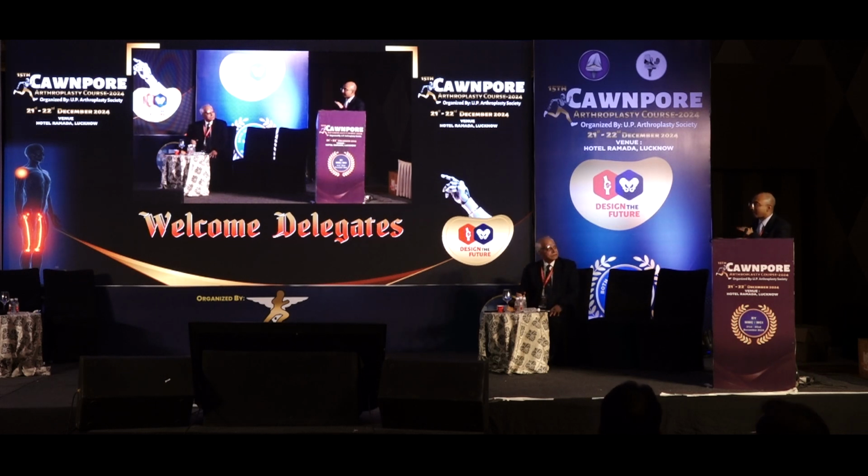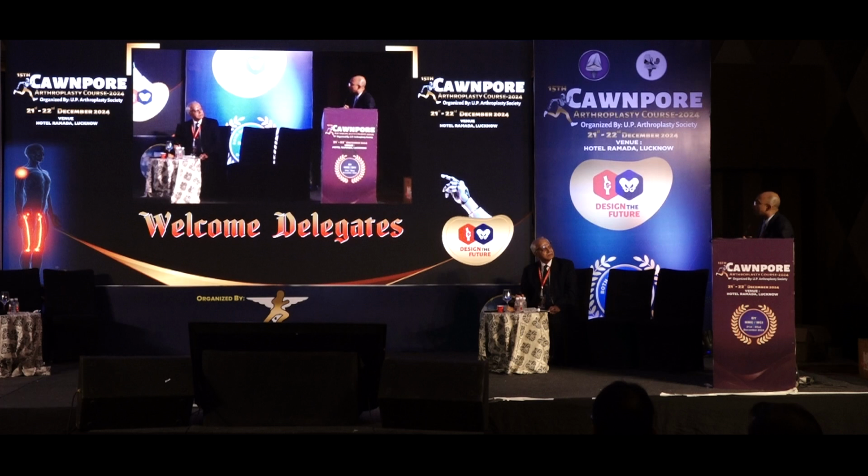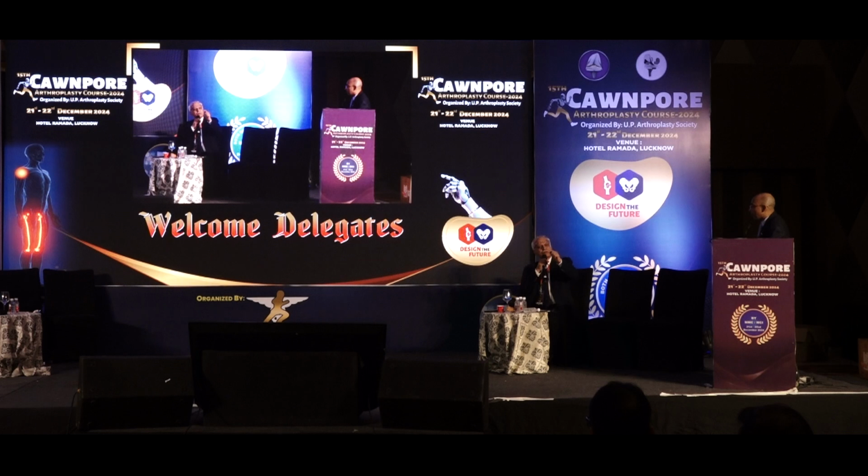Sir, if it is a 5 to 8 mm defect and only 10 to 15% of the tibial tray is uncovered, maximum 20% in the posterior part, then probably I will not use a rod, but otherwise I'll use a rod always. If the defect is only in the posterolateral or posteromedial, less than 25%, and if it is more than 5 mm, then I'll use a rod. I'll bypass it with a rod.